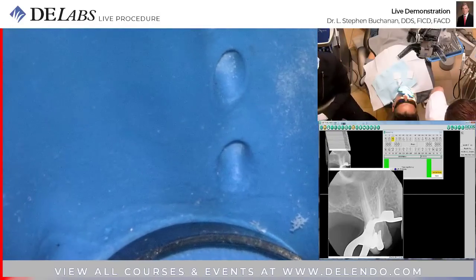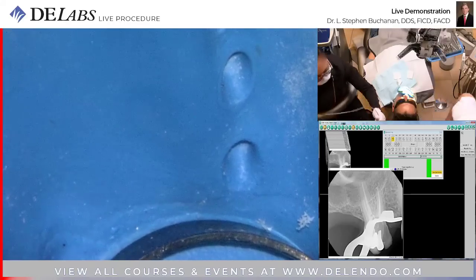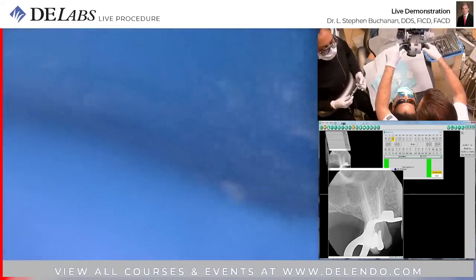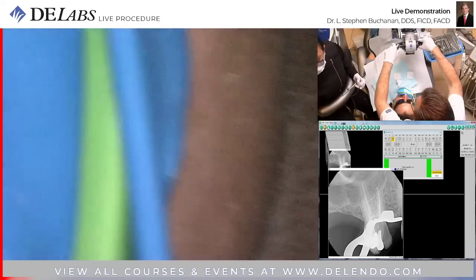There we go. No fireworks. It doesn't matter. Canal's clean and filled. We got it. We got everything done that needed to be done. Let's go ahead and take this out with some air abrasion.